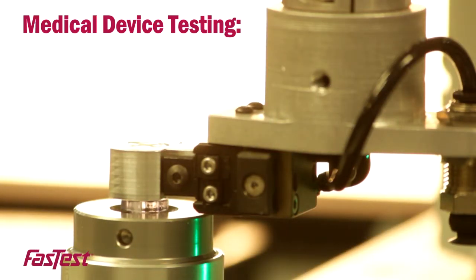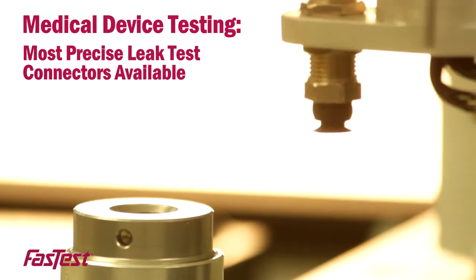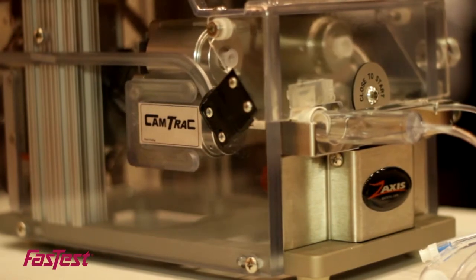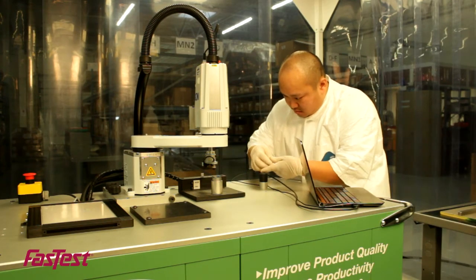With no room for errors in medical device testing, FasTest designs and engineers the most precise leak test connectors available. Our patented connectors for testing standard and non-standard catheters, medical tubing, luers, and lumens are manufactured under clean room protocols.